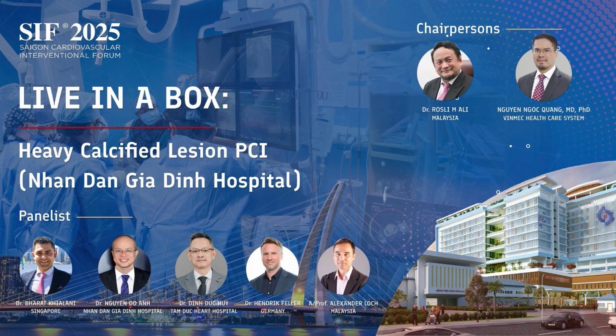Dr. Hendricks. Yeah, bigger balloon, reassess the MLA. If it's big enough, you can stent. If not, you need more ablation. Yeah, or a different technique, I mean. And one more thing I noticed is maybe some contrast staying at the ostium of the left main. Is it from the beginning? Is there some dissection there at the left main at this moment?